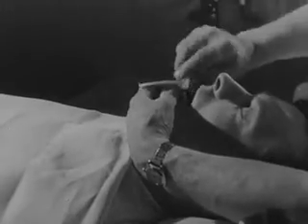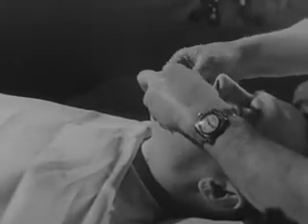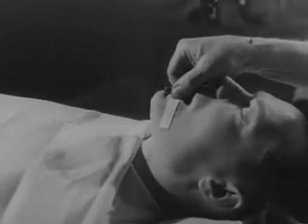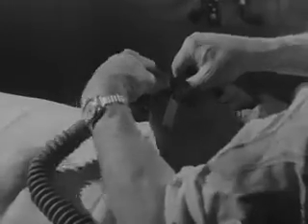When it is in the trachea, and there should be no doubt about this when a laryngoscope has been used, the metal connection should be strapped to the patient's face by adhesive plaster. The hose from the anesthetic machine is then fixed in position.